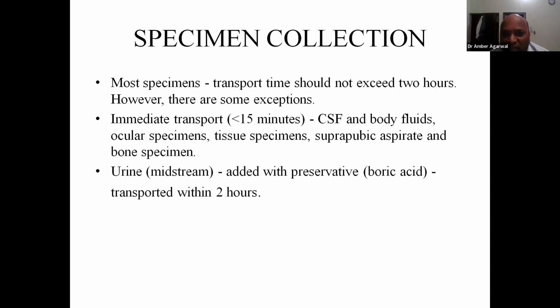So what we have seen is you can keep the sample at room temperature, because most of the labs are not that close by that you can send the sample in such amount of time. However, most of the books have mentioned these time frames within which the sample should be sent, and if not sent, should be rejected. There's a rejection criteria also, but not all the labs follow this.